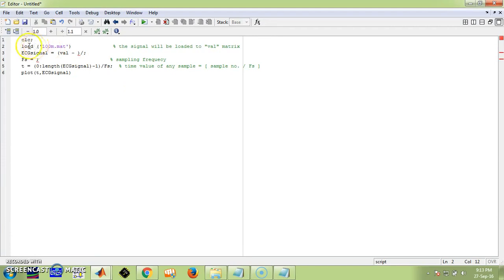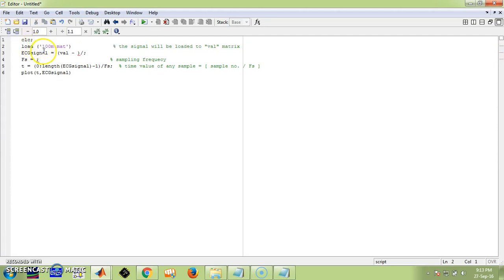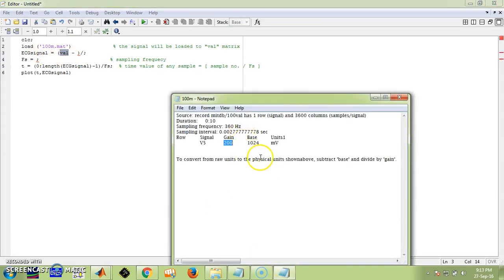MATLAB already knows that whenever we write the load instruction, it automatically loads this particular data into the val variable or val vector. We need not write the val variable explicitly — MATLAB will automatically consider the destination where it needs to load the data, so automatically the data will be available in val. As given in the information file, we need to convert raw units into physical units, into millivolts.